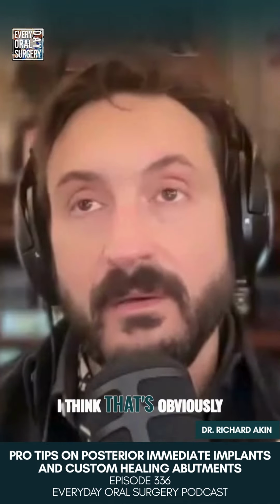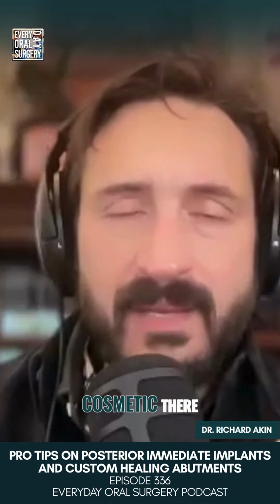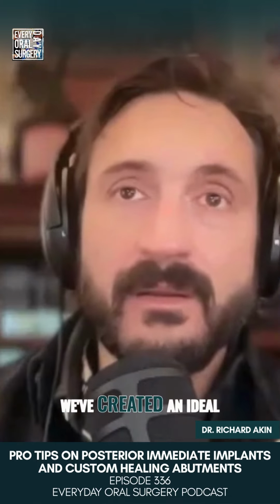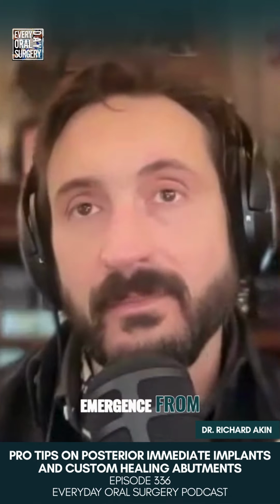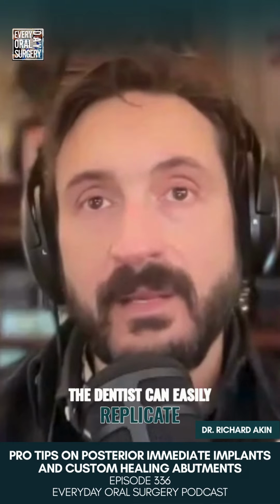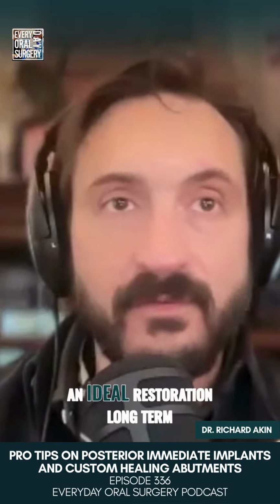Obviously they want to have something cosmetic there, but ultimately what's better for the patient is that we've created an ideal emergence from day one that the lab can replicate, the dentist can easily replicate, and then we give the patient an ideal restoration long term.